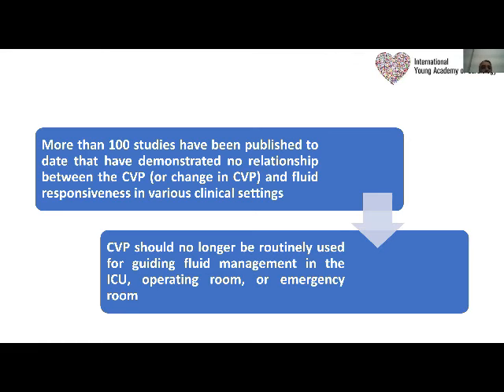More than 100 studies have been published in the last 10 to 15 years trying to demonstrate a relation between the CVP, or even change in the CVP, and fluid responsiveness. And CVP measurements are no longer required to guide fluid management in the ICU.